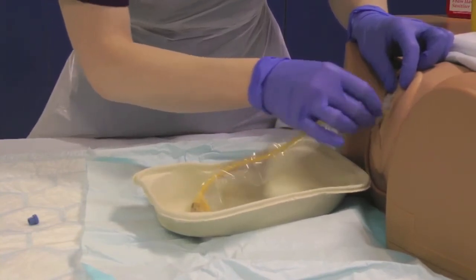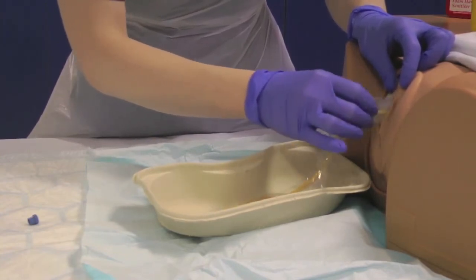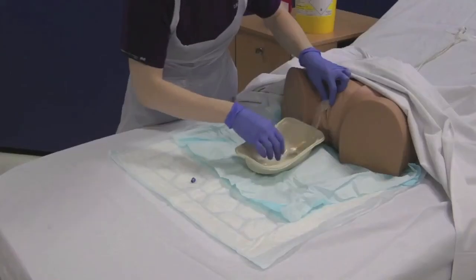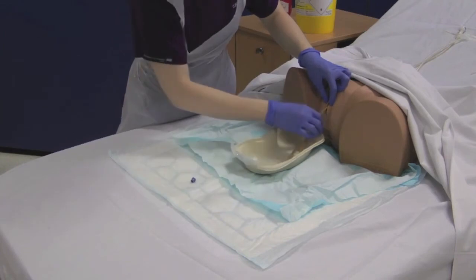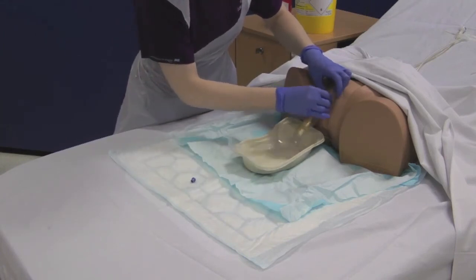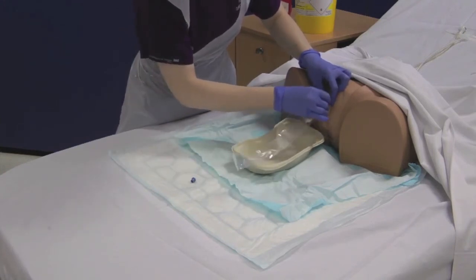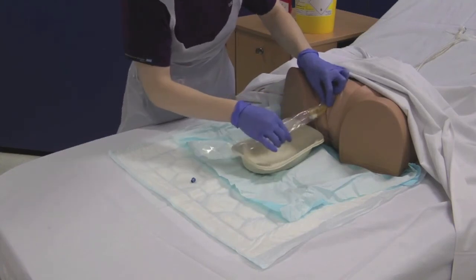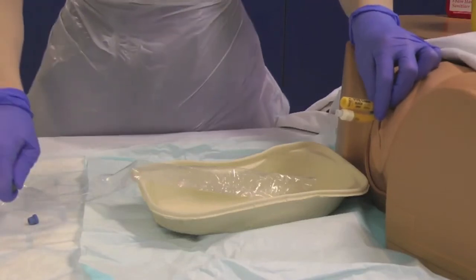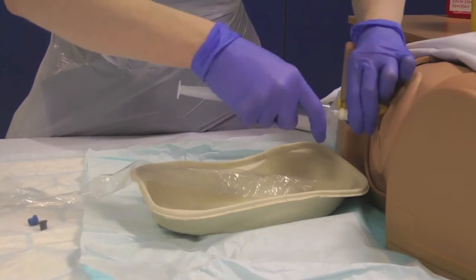You may need to part the labia at this point. Insert the catheter along the urethra into the bladder. If there is any resistance, ask the patient to cough, which may ease insertion. Never force the catheter. Once the urine starts to flow, advance the catheter a further 5 centimeters. Take your 10 ml of sterile water from your sterile field and inflate the balloon, observing the patient for any signs of discomfort.